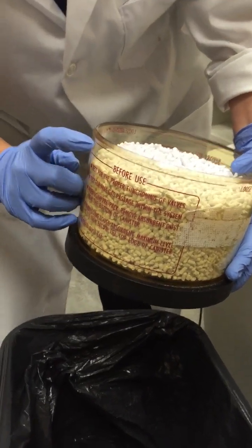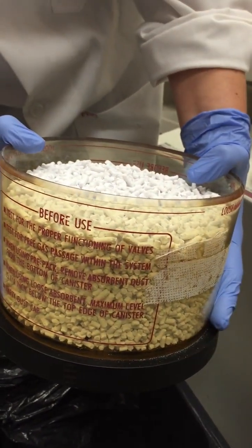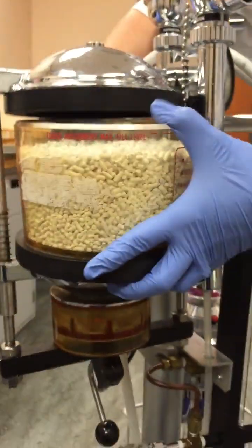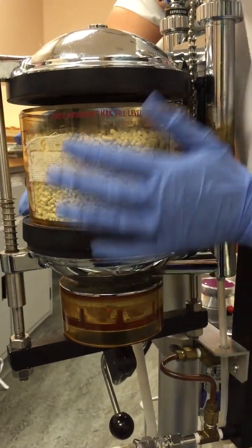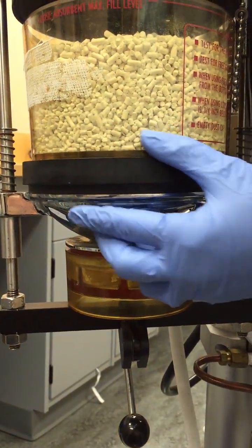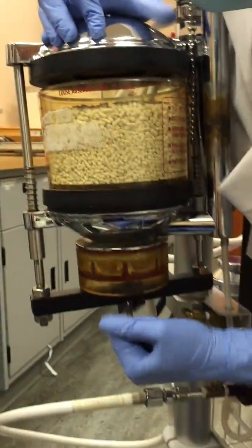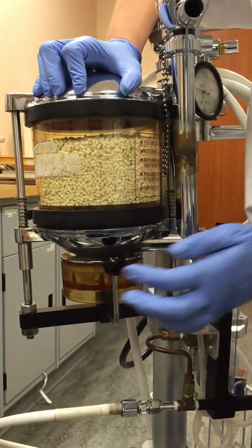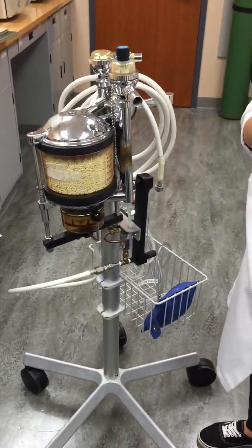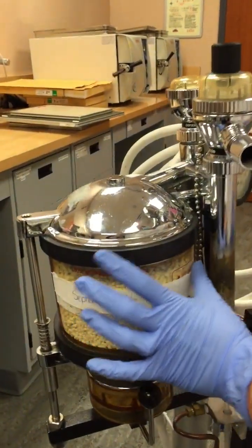Okay, and you'll see there's a line right here that says this is the maximum fill line, so you don't want to go above that. So where we are right now is a good level. Now I'm going to slide it back into place, and you can feel that it sits properly on the little circle ledge there. Then I'm going to put my hand on top just to secure it. Then I'm going to take the handle and pull it back up and lock it in place. Okay, now the filling is complete and I'm going to put a sticker with the date and my initials of when it was changed.